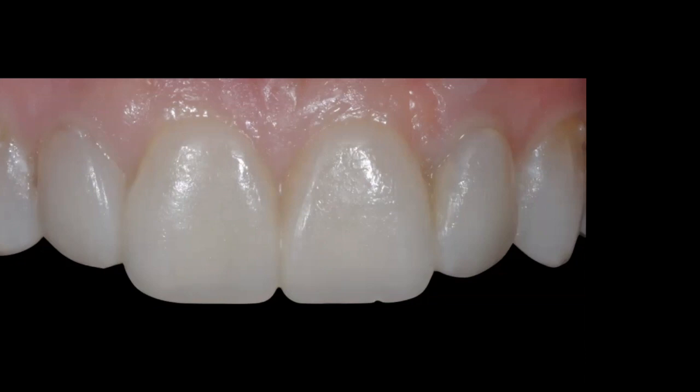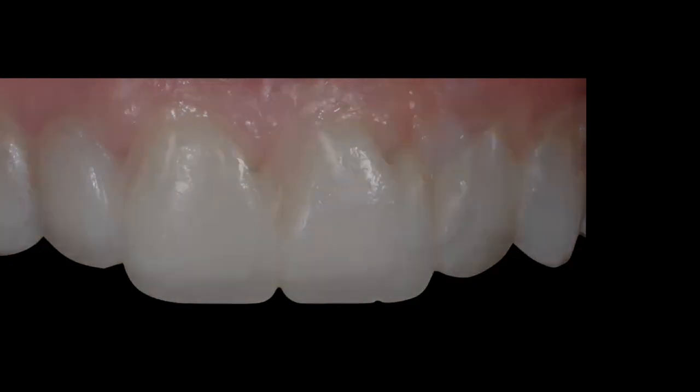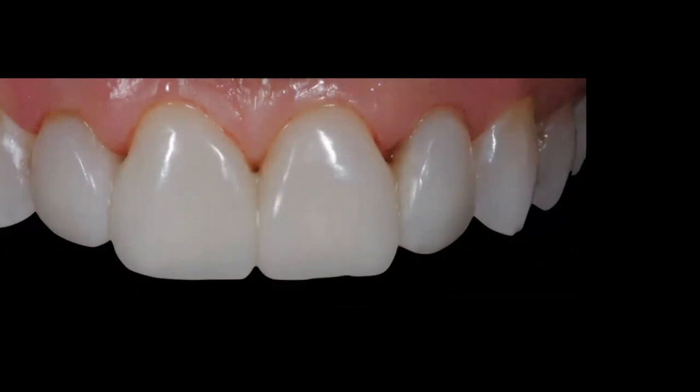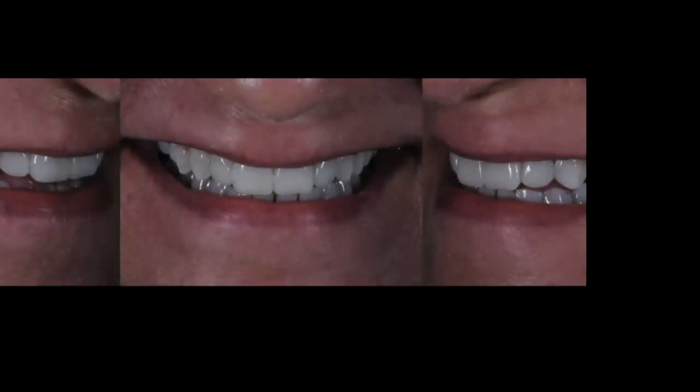Because there's no anesthetic, I can immediately evaluate the patient's smile and phonetics, have a conversation, and take photos. Then I use a very small fine diamond mosquito bur, go around the gingival contours to remove flash, open the embrasures slightly so the patient can use a soft pick to clean between the prototypes, and then polish. This takes me 15 to 20 minutes.